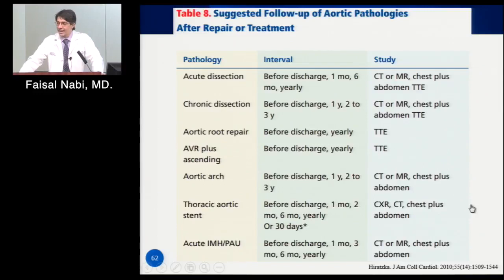On the flip side of that, I can tell you we have our dual source scanners where we're doing flash imaging, or imaging with a very high table speed, a very high pitch. And I can tell you I can do at least a full thorax CT at maybe 1 to 2 millisieverts, depending on patient size and things like that. So even there we've significantly improved. So I mention it.